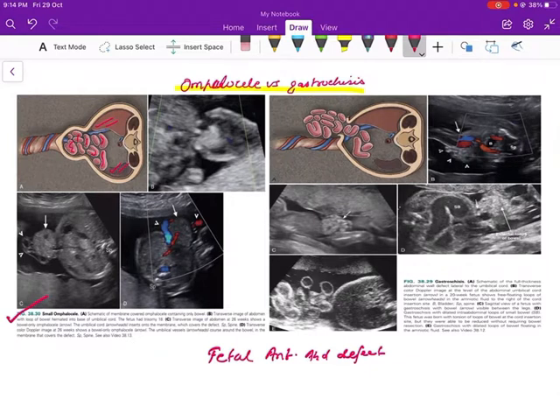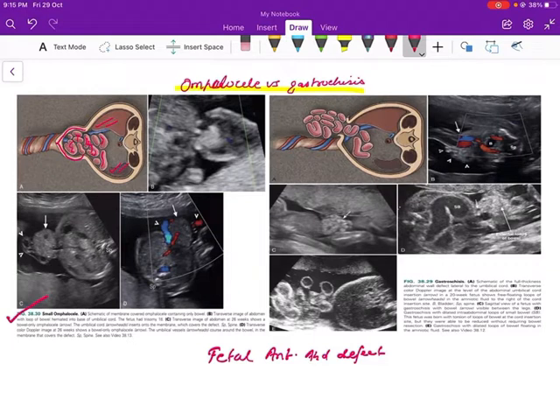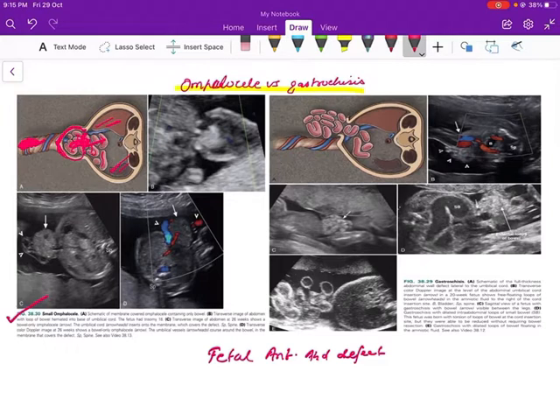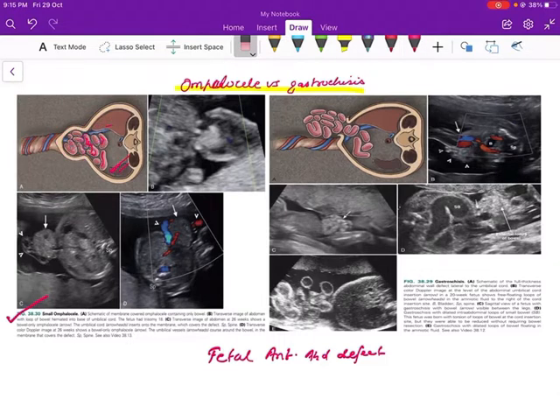The herniated small bowel loops are actually covered by a membrane — the peritoneum, the Wharton's jelly, and the amnion. The umbilical cord insertion level is abnormal; the umbilical cord is seen inserting at the apex of this herniated mass. So omphalocele is a midline defect in the abdominal wall umbilical region, with herniation of bowel loops, liver, and spleen, all covered by a membrane, and abnormal cord insertion at the apex of the herniated mass.